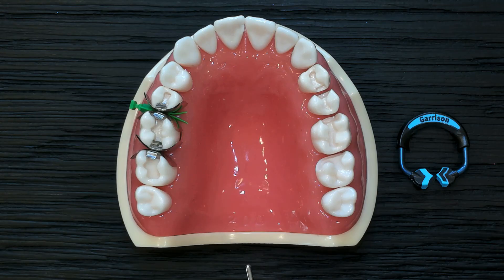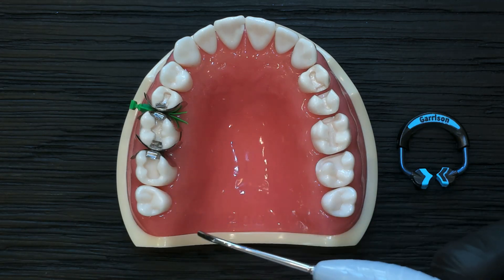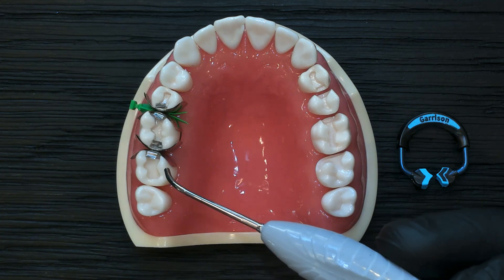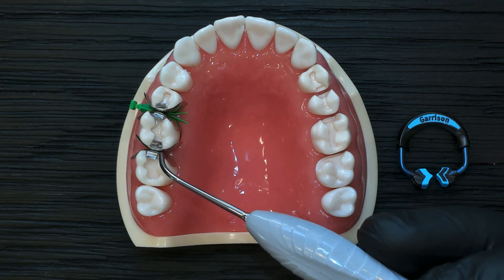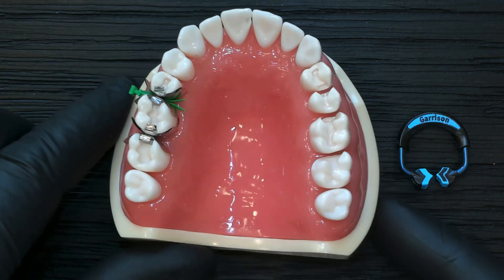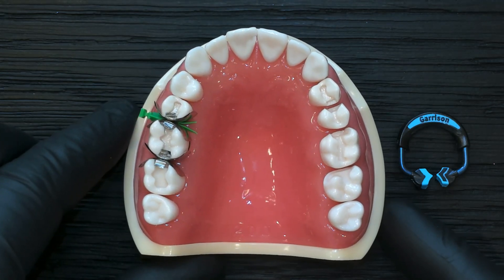In this video we're going to discuss matrix band thicknesses when we place two matrix bands in a back-to-back situation. We often wonder: are we achieving enough tooth separation to account for both matrix band thicknesses, so that when we're done we're not leaving a gap or space?